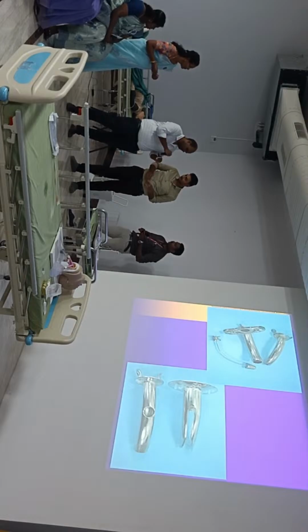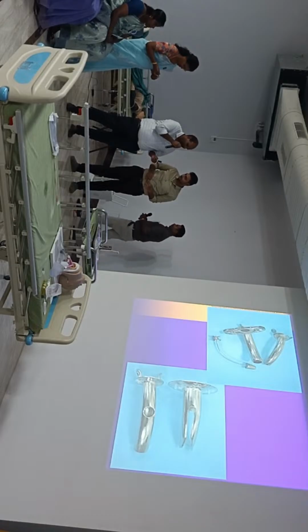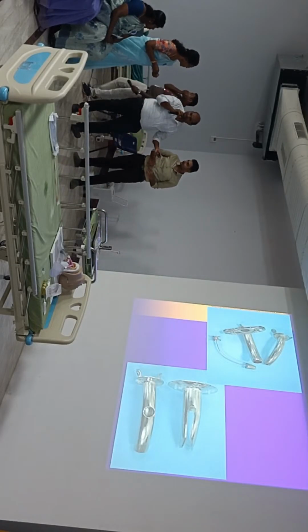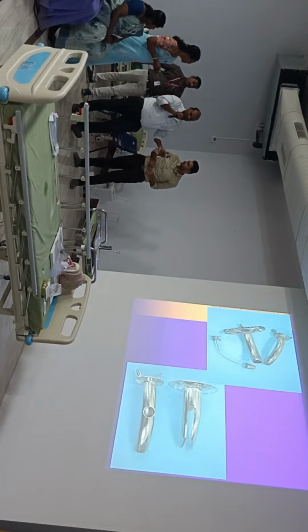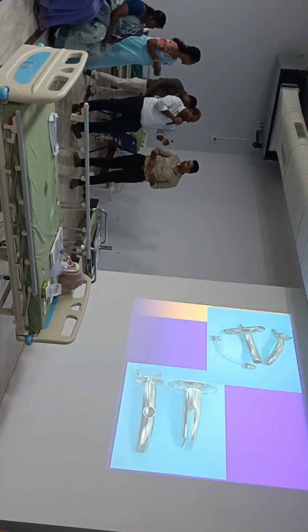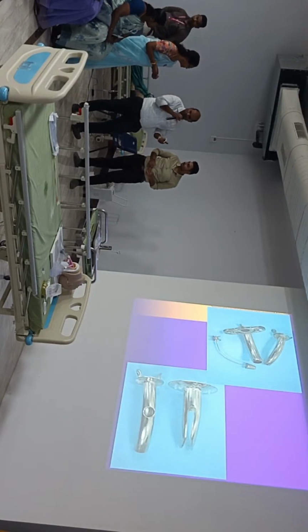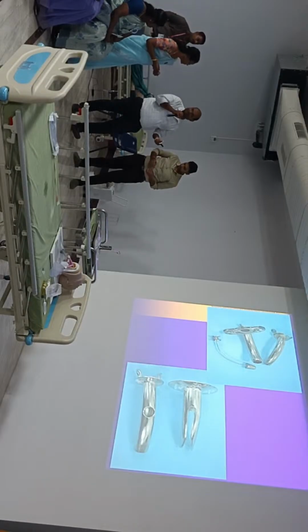What that indicates is the inner diameter of the tube. So in adults, both the sizes will be the same. In adult males we generally use 32, 34, 36. In females, 28, 30, 32. We generally don't use metal tubes in pediatric patients.